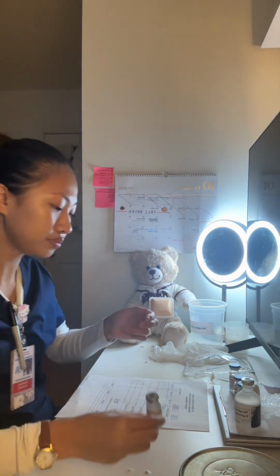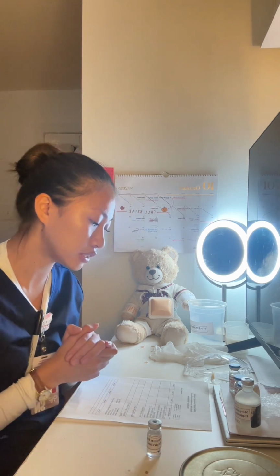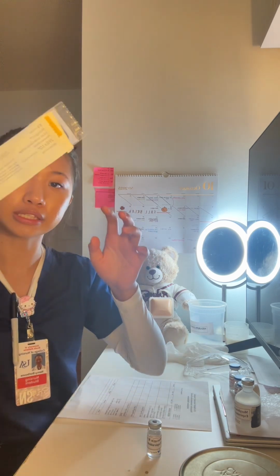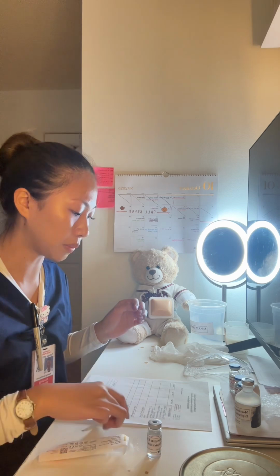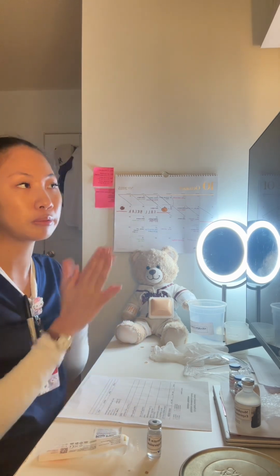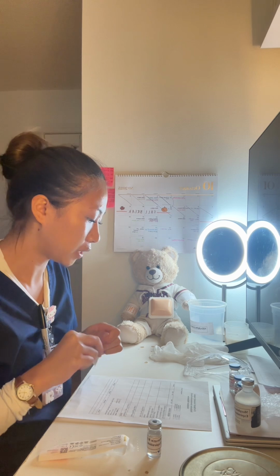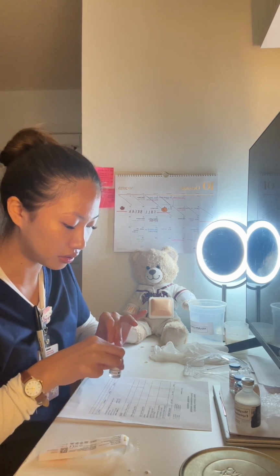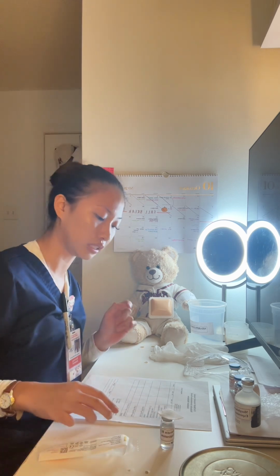Next, I would need 10 units of this. Since it is an insulin injection, I will use an insulin syringe here. And I'm gonna take an alcohol prep pad. So I'm gonna go ahead and perform hand hygiene. Take this alcohol pad, clean the top of the vial, and leave that on there just so I know that I have cleaned it.